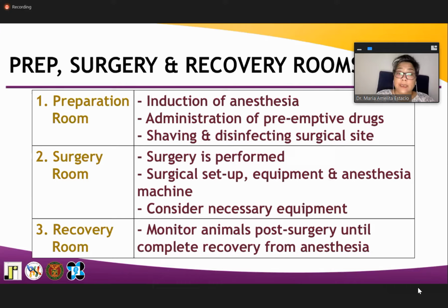And after the surgery, we transfer the animals to the recovery room. The reason for this is because usually there are multiple surgeries that can be done. It could be the same surgery for that specific study, but it would require, say, several animals in a day in the performance of the surgery. So you need to move those animals that finish the surgery to the recovery room for monitoring and eventual recovery from anesthesia. And from there, they can be transferred to their animal room.